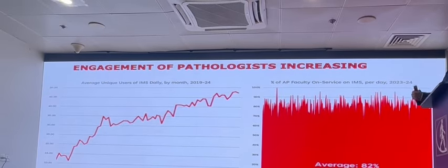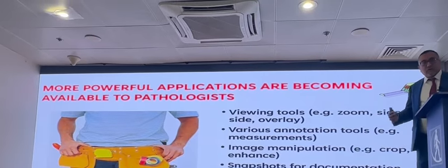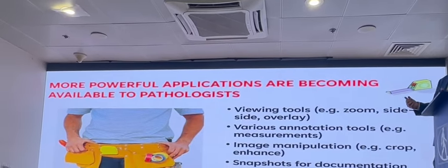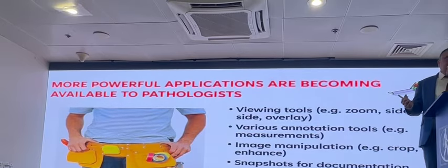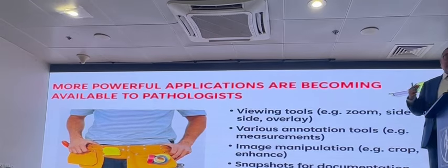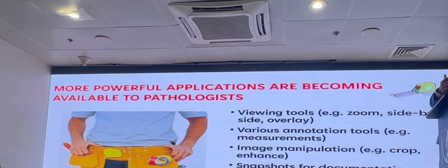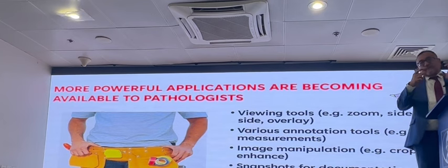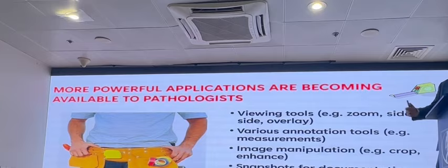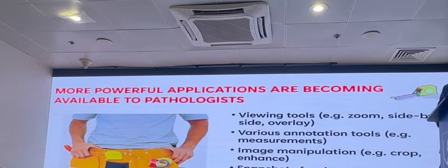So once you have the slide digitized, you have a lot of tools available to you. You have viewing tools, you have annotation tools, you have image manipulation tools like cropping and enhancing. You can take photos from this directly. So we don't buy microscope cameras anymore. Everybody is using this. We have ability to analyze these images.